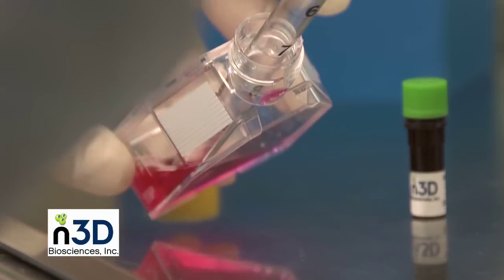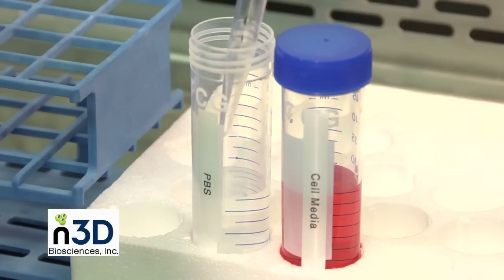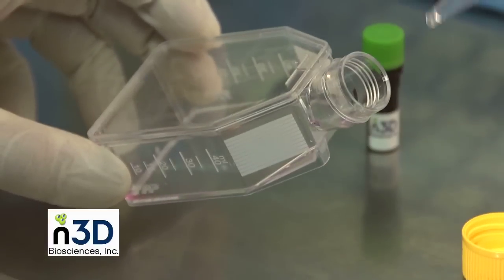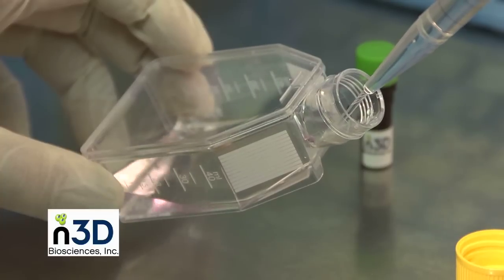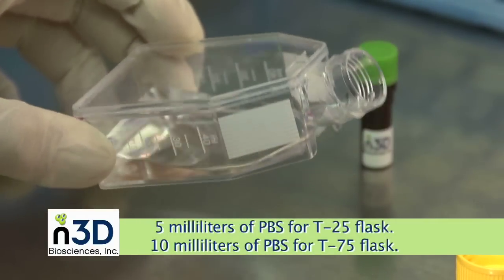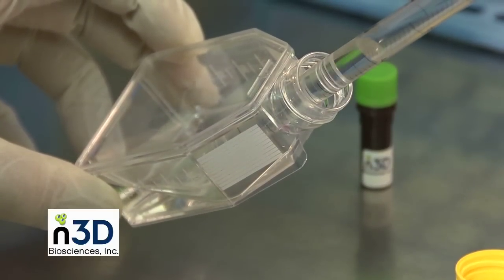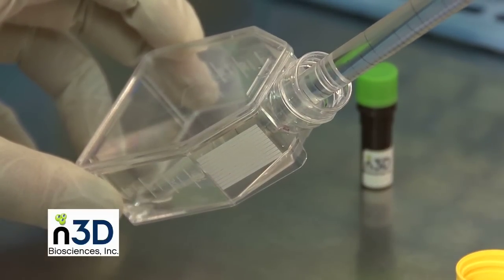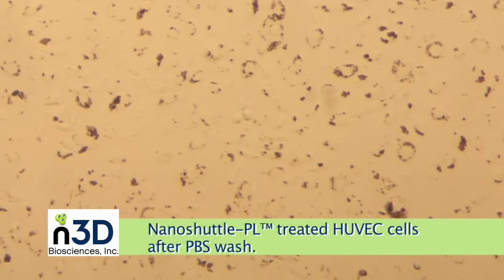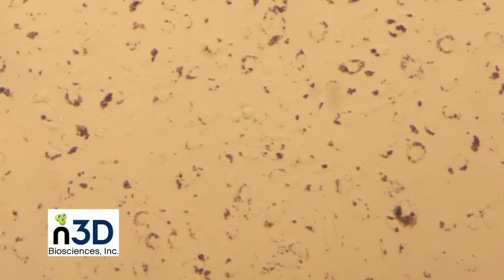After the incubation with NanoShuttle PL, remove media and perform a PBS wash. The PBS wash will remove any residual media and unbound NanoShuttle PL. After adding PBS to the flask, gently agitate it. We recommend 5 milliliters of PBS for a T25 flask and 10 milliliters for a T75 flask. Next, remove the PBS with a pipette and discard it. Here we see a common cell type, Huvec, in a flask after the PBS wash. The slight darkening of cells indicates the uptake of biocompatible nanoparticles that are required for levitation.